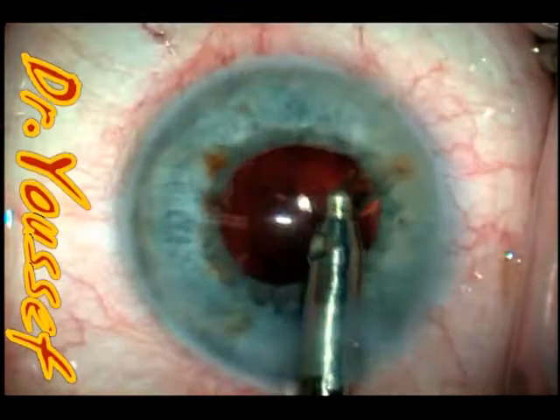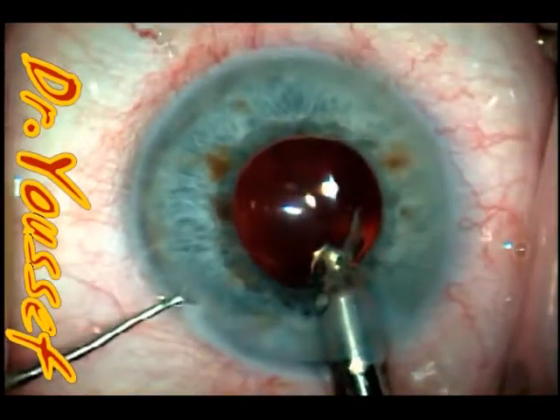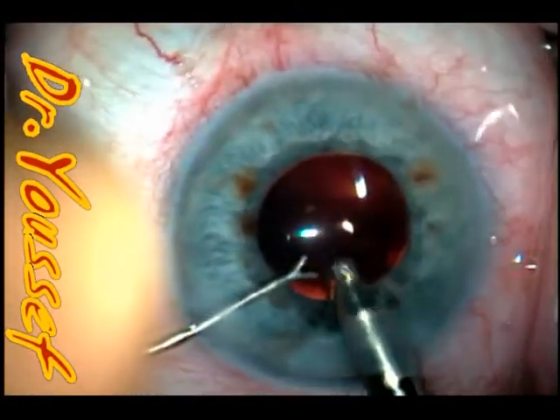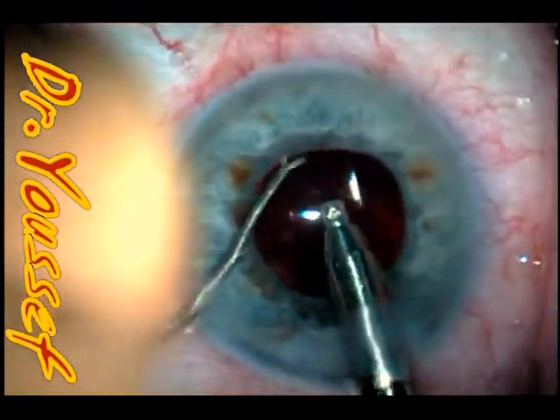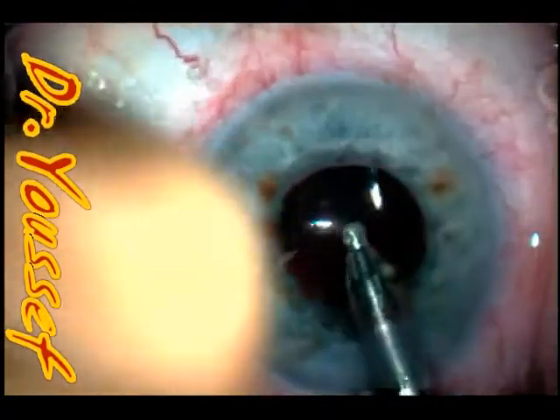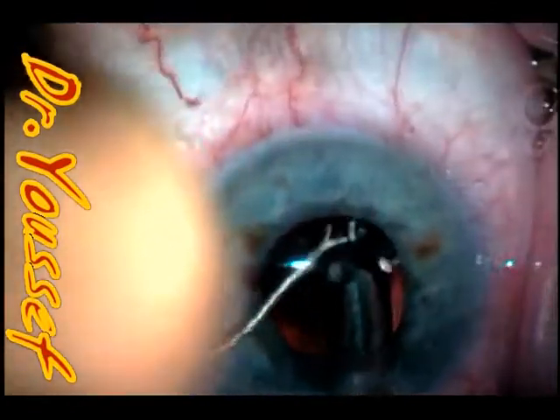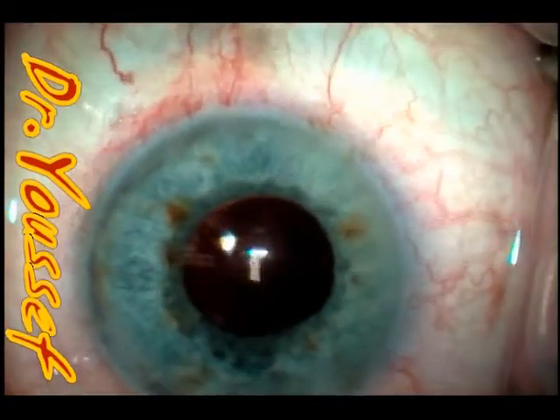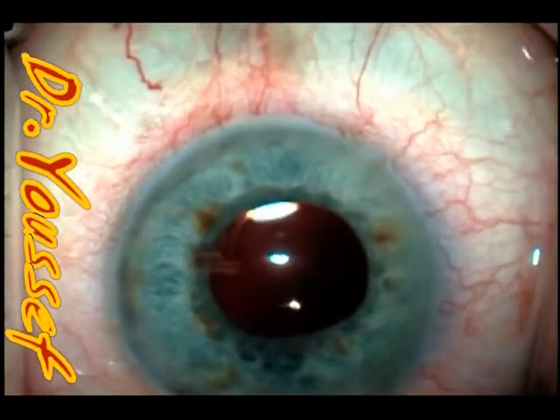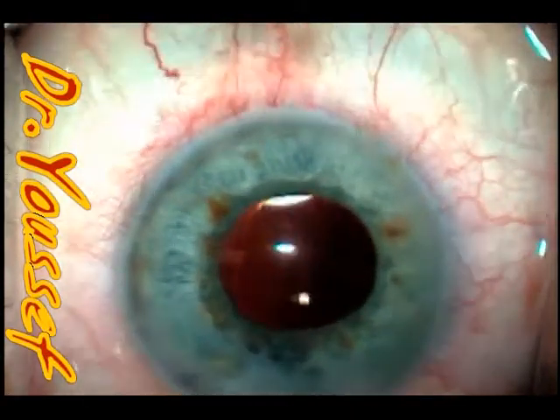This case went really well. In our area in northern New Brunswick we have a lot of pseudoexfoliation families and it's a very common finding — in a typical day of 18 cases you can find four or five pseudoexfoliation cases. I had a little bit of harder cortical material so I had to break it down with the Y-cannula through the IA. I use the Y-cannula to push the iris around and make sure there's nothing hiding behind the iris. When you do small pupil cases, you have to make sure the anterior chamber is clear of cortical material, as these are the cases that can have retained cortex with postoperative uveitis. Thank you very much for watching.